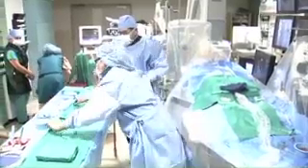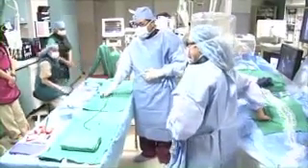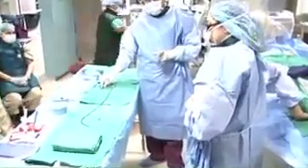All right, so the next step is that we're going to show you the devices before we go back to Dr. Roberts, who will explain how we do this. Can the cameras come over here? So we have different catheters that we use. First of all, we're going to measure the length of the tunnel that we're going to close. And for that, we use a balloon, which is here. We're going to exchange wires. We put an introducer there to put a big balloon through, and then we'll see in a second.